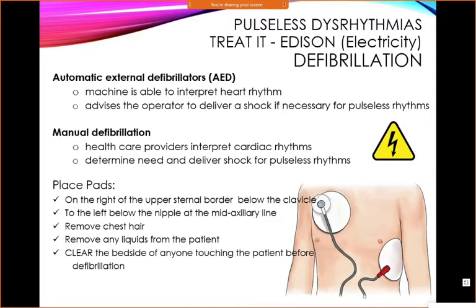So that's pulseless, and just placing the pads exactly the same as you would with cardioversion, except that you are not syncing it. You're just throwing electricity onto it. We don't need to time it. The patient is not conscious. The patient has no pulse. You just throw electricity at it and see if it works.